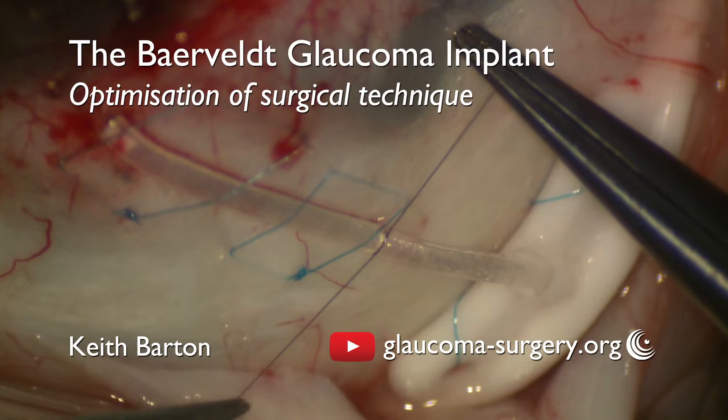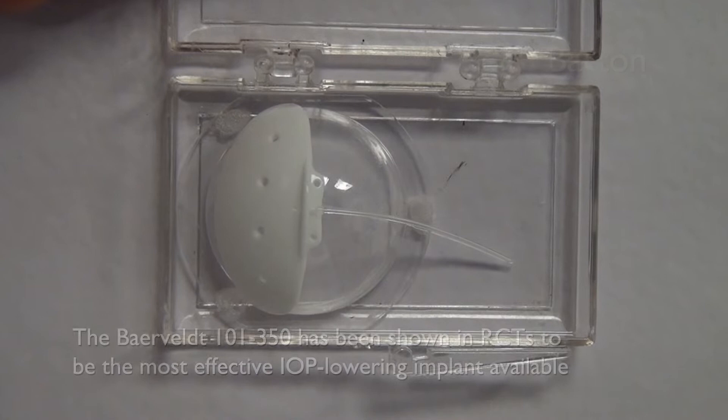Hello. In this video I will describe my technique of aqueous shunt implantation with specific reference to the Baerveldt implant.